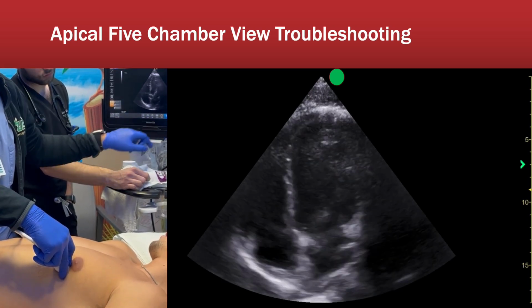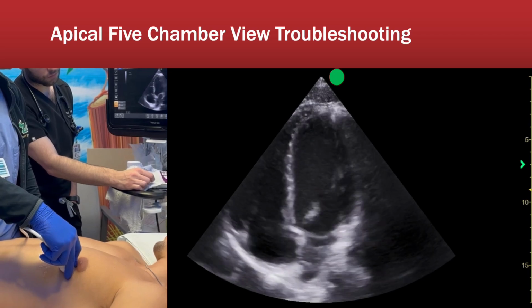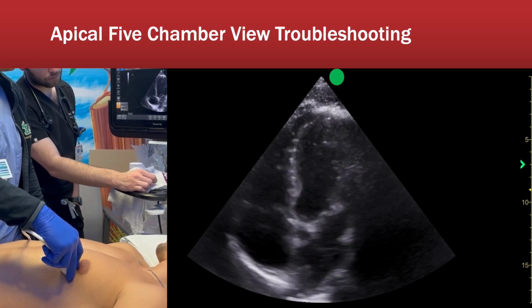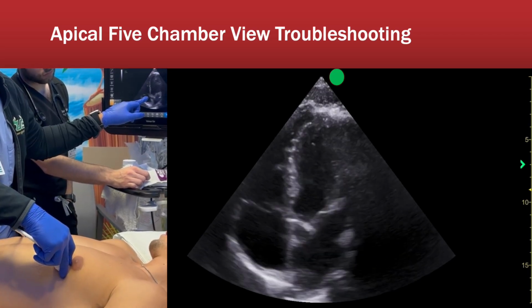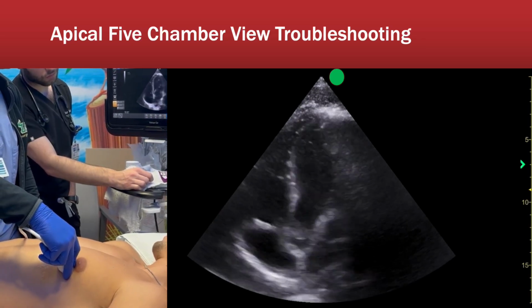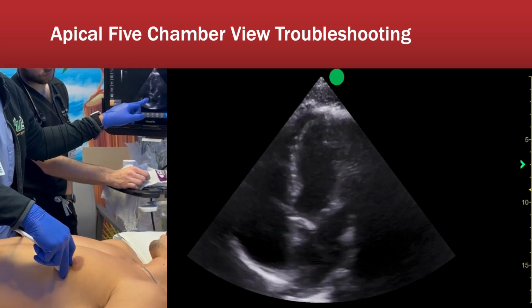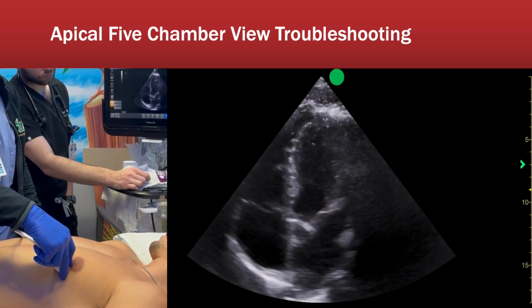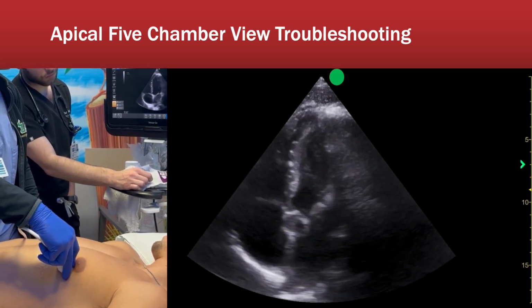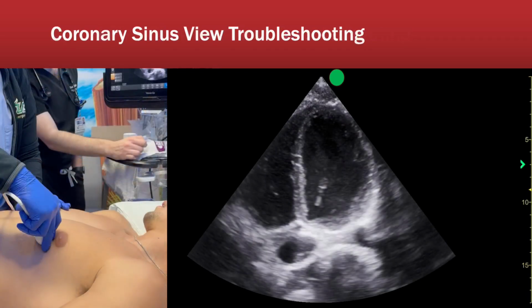Again, it's a very minimal, very slight motion just to open up those atriums and get rid of that aortic valve. So again, you see my hand slightly coming upwards like you see here, and that will take the picture from having that aortic valve to it disappearing and having your 4-chamber like you have here.